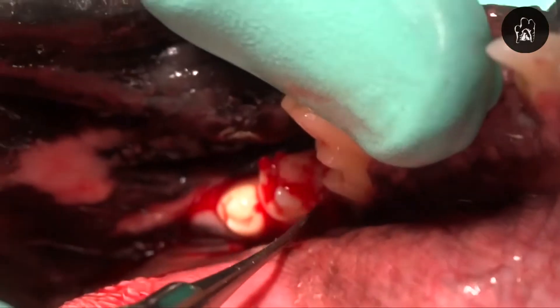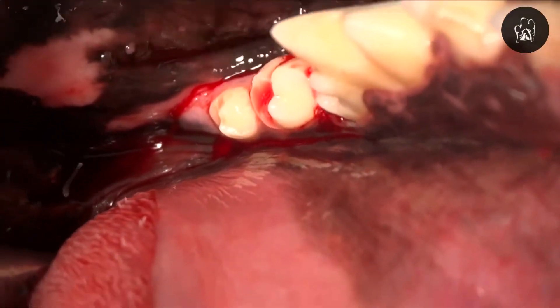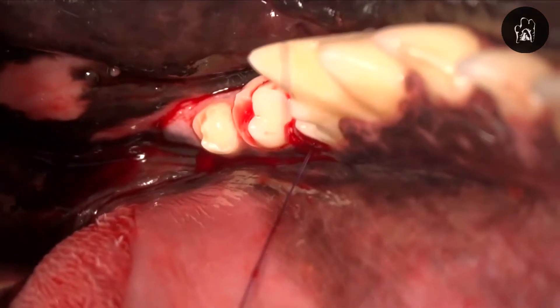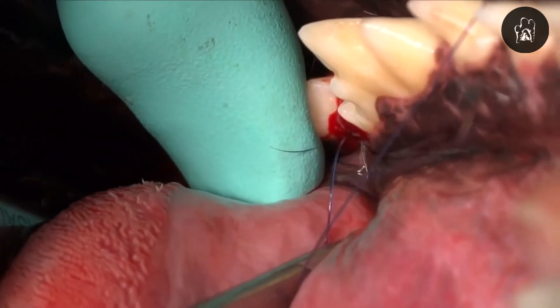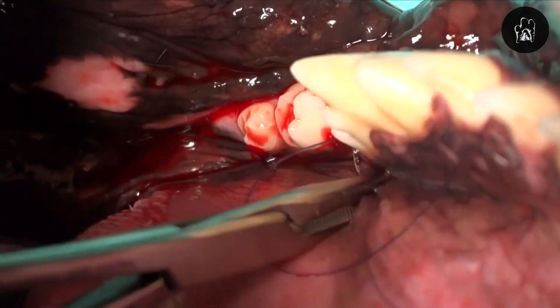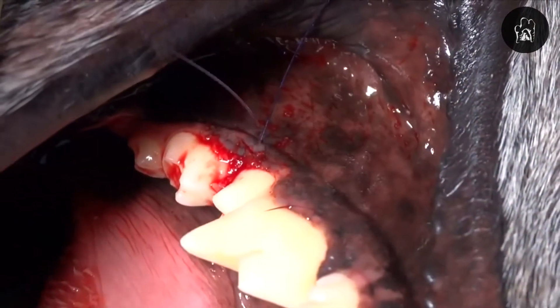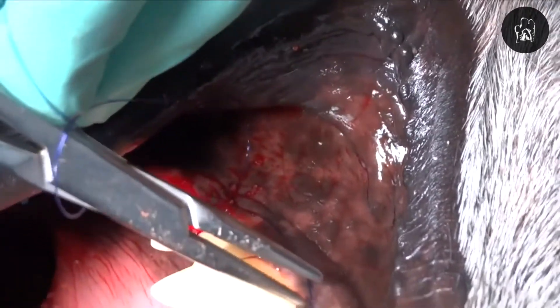And we may at times, depending on what that looks like, need to open up the lingual side as well to expose that and be able to visualize it in order to clean it out properly. Now what we're doing here is placing a horizontal or vertical mattress suture pattern where we go from vestibular to lingual and back lingual to vestibular, and tie to keep that bone graft in that defect and re-oppose the gingiva up to the tooth. You can see how we're doing that using the papilla, and in this case a horizontal mattress pattern to oppose that little papilla up against the interdental space between those two teeth.